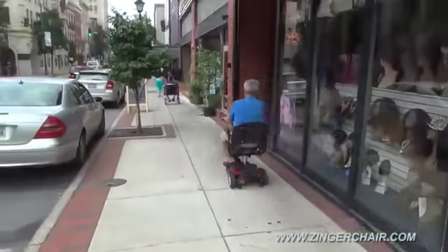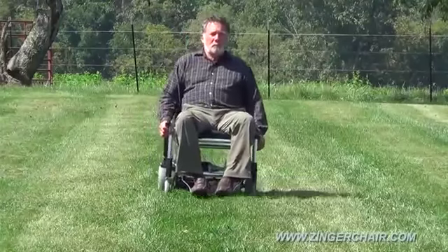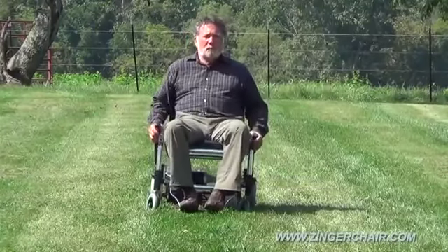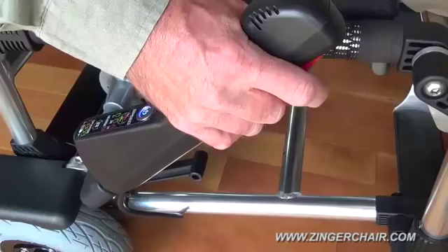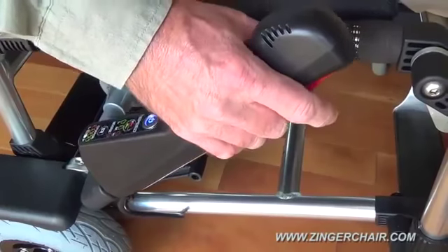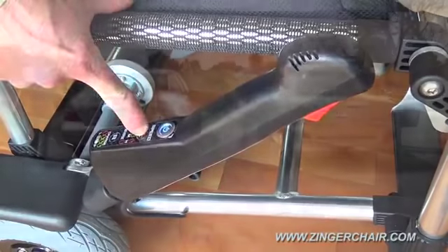Nothing steers like a Zinger. Press both hand levers down to go and pull them up to brake. Use opposite lever actions to turn. A trigger grip controls the speed while a turtle-rabbit button limits the top speed for indoor use.